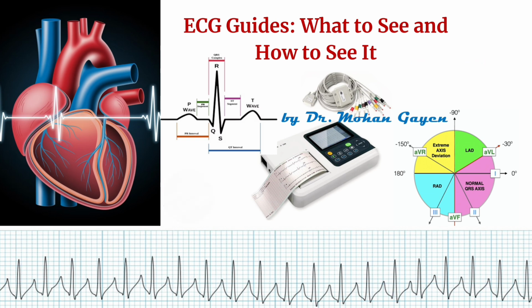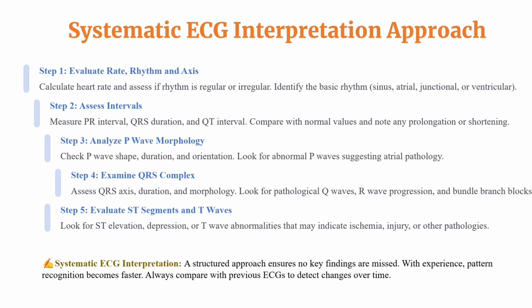Now, we shift our focus to one of the most crucial aspects of ECG interpretation: heart rate determination and cardiac rhythm analysis. The rhythm of the heart is not just a simple beat. It is a precisely coordinated electrical sequence that ensures blood is pumped efficiently to sustain life.